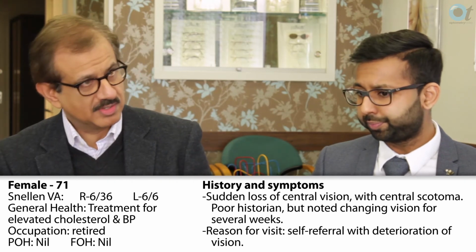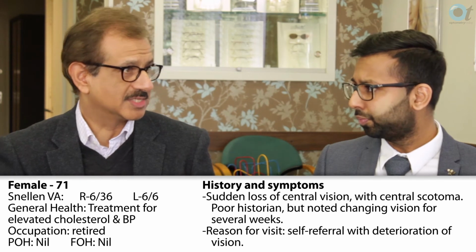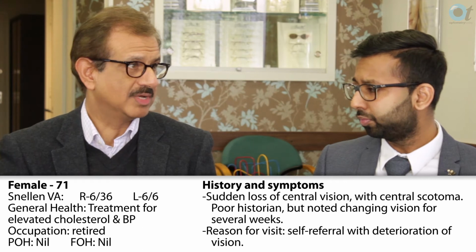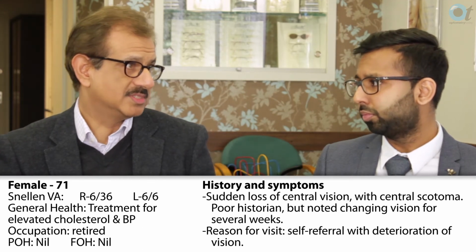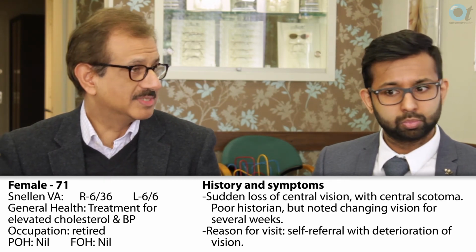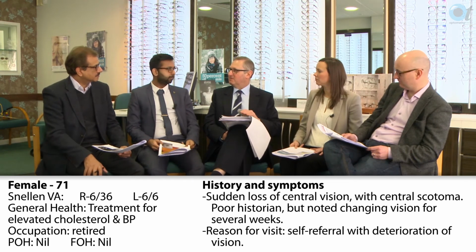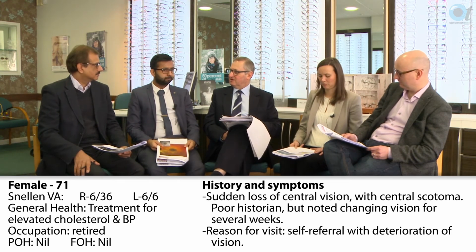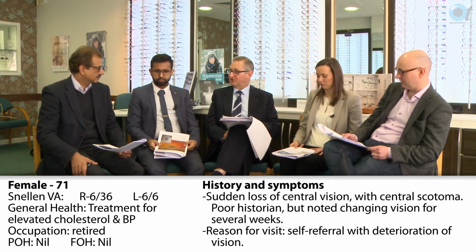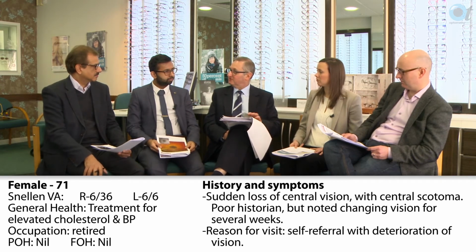If the other eye, following OCT, showed that she's already had a posterior vitreous detachment in that region, her risk of getting a macular hole in the good eye is pretty low. So following OCT, which I go with Kerry, it would be nice to see the other OCT, we would be able to estimate whether the other eye is at risk or not. What happens if we have the other eye that shows that there are early signs of vitreomacular traction on that eye? Would that alter your approach, or do you feel differently about it?